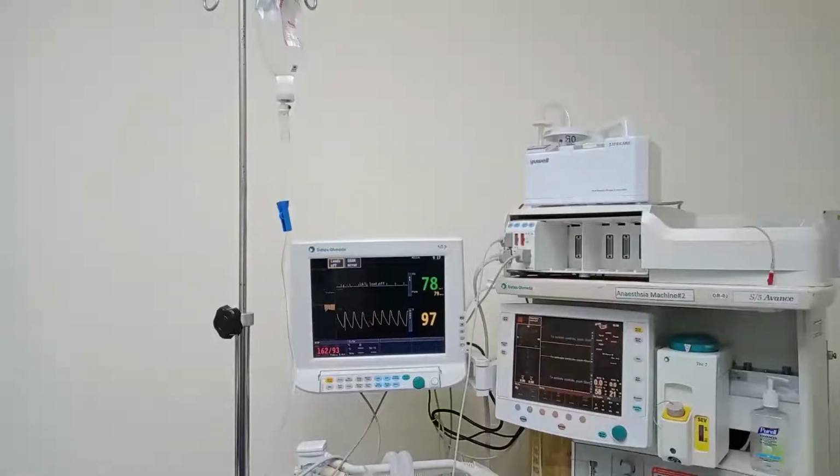Now we have completed our first video of caudal neuroplasty. Now we will be moving on to our second procedure, which is a transforaminal approach to the epidural injection. We'll be doing a transforaminal epidural in this session.